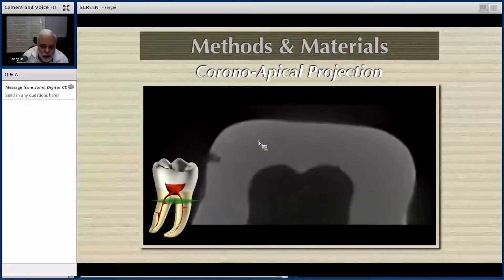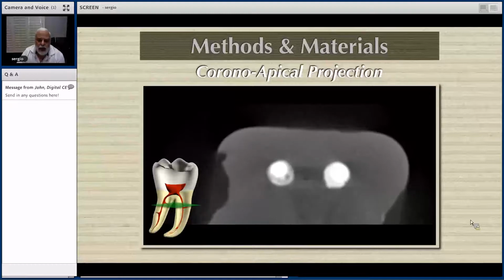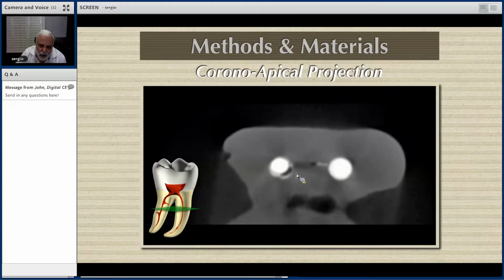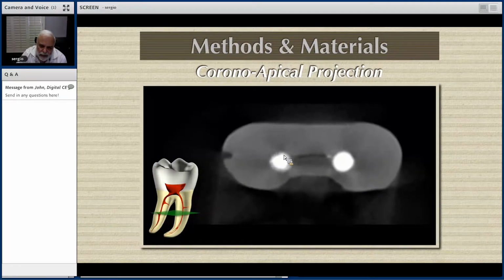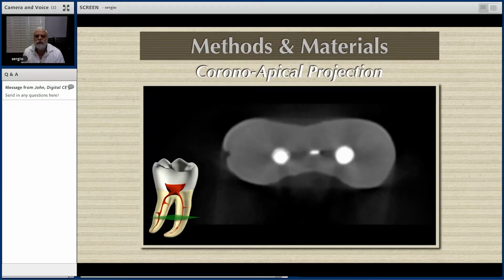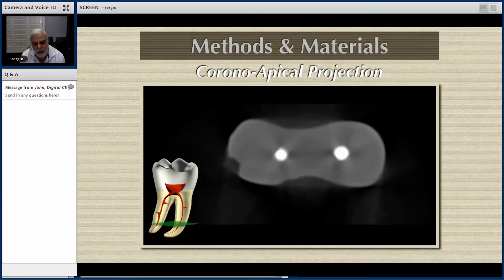This is where the section is. Here you're going to see the single cone technique, okay? And here you see the core obturator. On the single cone, look at all the voids. This is the single cone, the cement, and all the voids, and zero voids right here. Zero voids on the core obturator material, all the way to the apex.